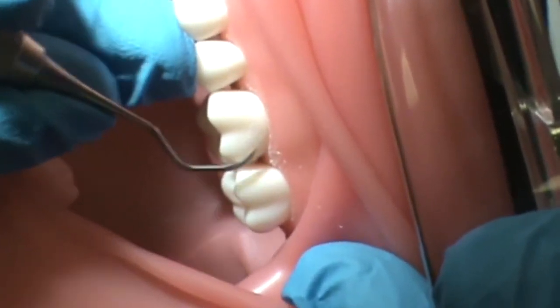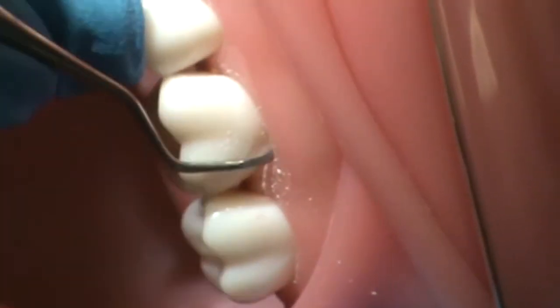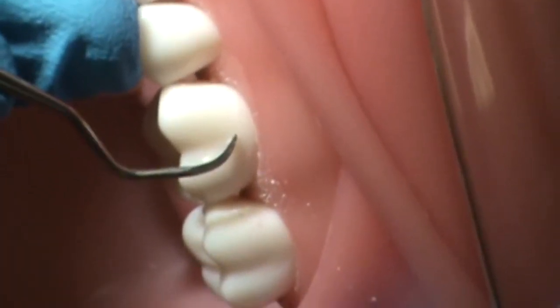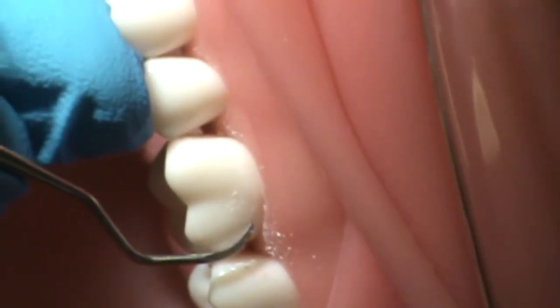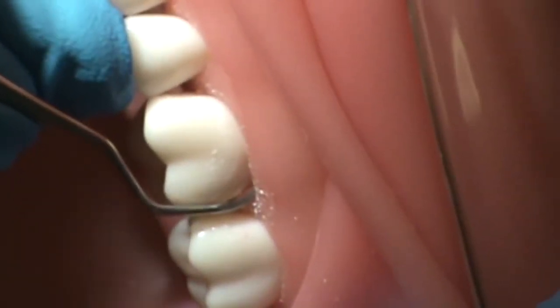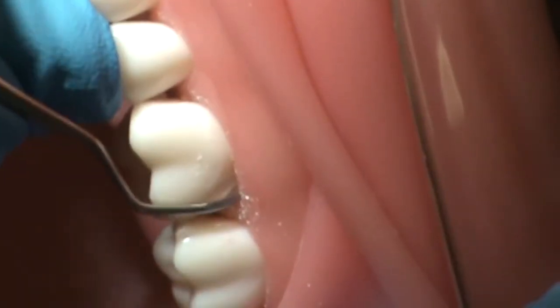She can either scale subgingivally or supragingivally with this instrument, and we're going to demonstrate subgingival scaling. Ms. McFell will gently slide the instrument under the gums at the distal facial line angle, hugging the root of the tooth at a zero degree angulation.